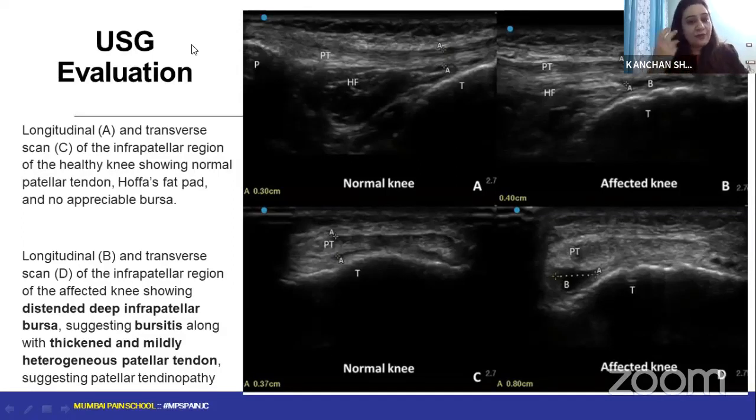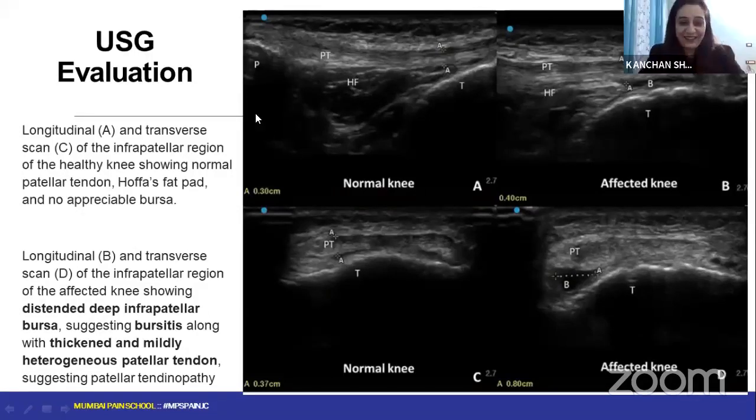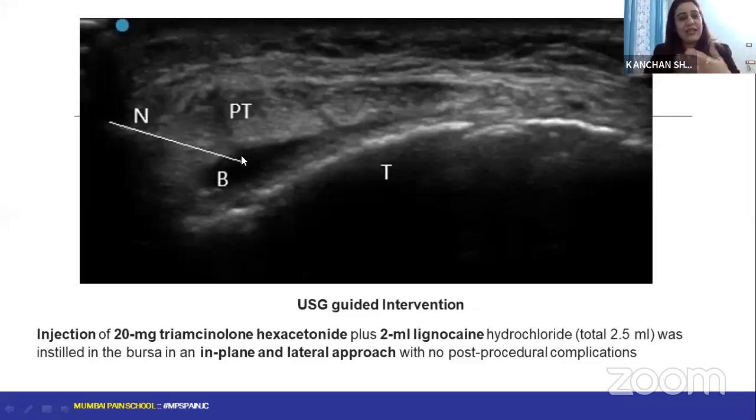So all these things you can very well find out with ultrasound, but there is no mention of anything. So I am not at all happy with the pictures they have put. They have even repeatedly said that they have measured the patellar tendon distance as well as the bursal distension, and they have not mentioned any values of the measurements that they have taken. The deep infrapatellar bursa you can very well see with ultrasound. Even physiologically you see some amount of fluid. So imagine if it were enlarged, you could see it very nicely.